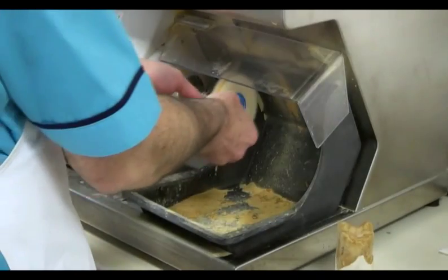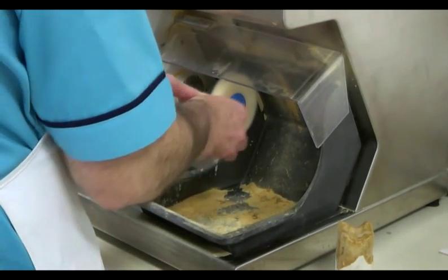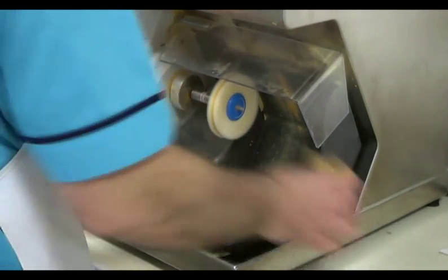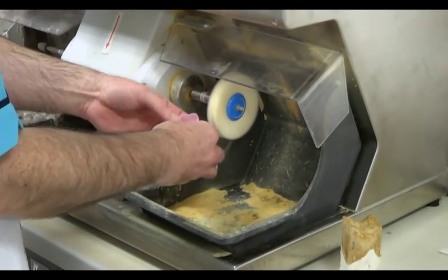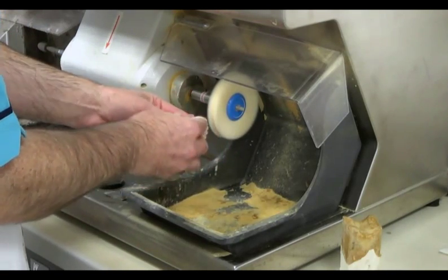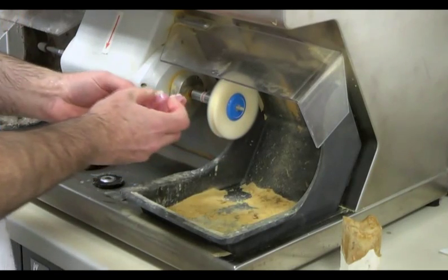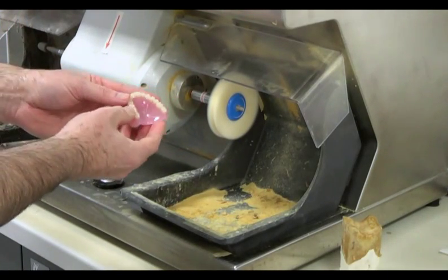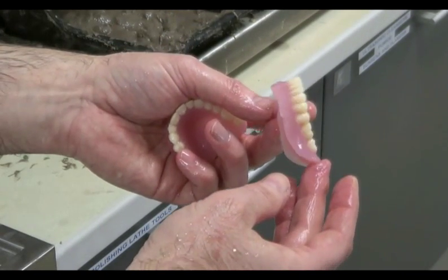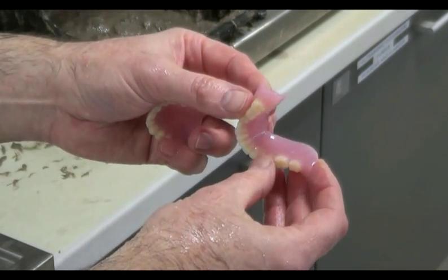Once a good matte finish has been created, we now have to polish to achieve the denture's required glossy appearance. We can achieve this using a cotton mop and a block of denture polishing wax. Again, it's essential to support the denture by spreading our fingers while applying pressure. When the process is complete, we should have perfectly finished dentures with a high gloss on both the sulcus edges and the contoured surface.